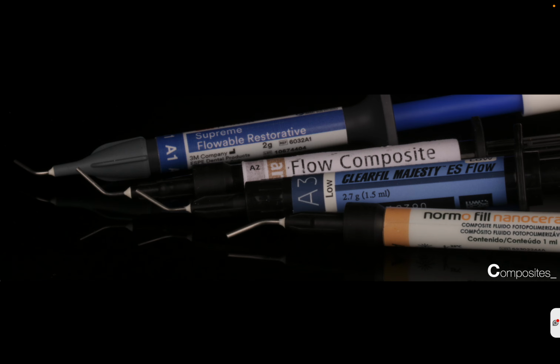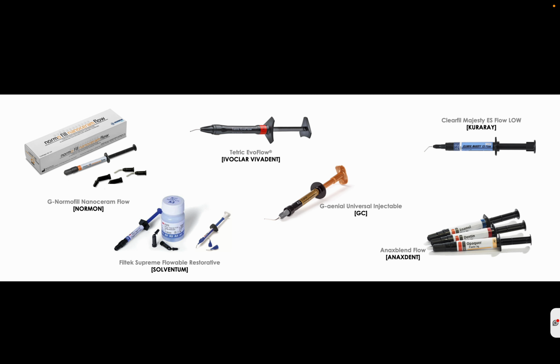Regarding the restorative materials, these are mainly flowable, no? Because they are materials that we can use in an easy way and adapt to all the surfaces. I work with all of them, yes, and there are some pros and cons.